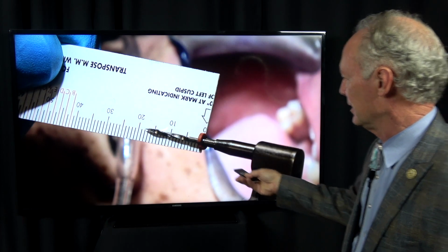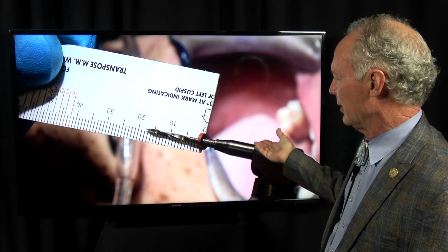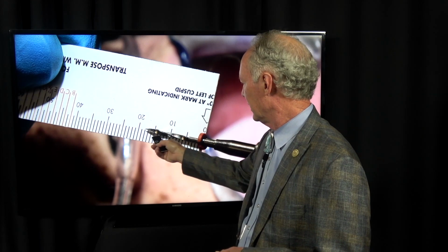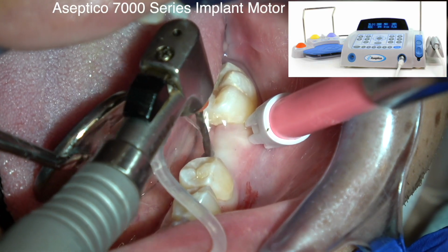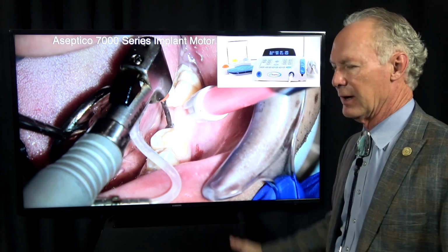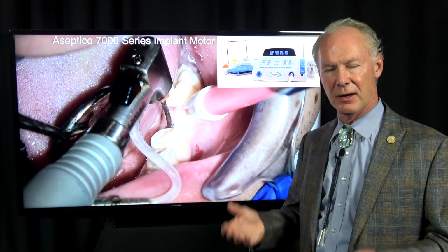Now this is the pilot drill with the rubber stop. So that measurement was 15.34. I'm measuring here about 17, but I'm going to move this stop and make the pilot drill about 14. Because what are you worried about when you place implants? Damaging the inferior alveolar nerve.